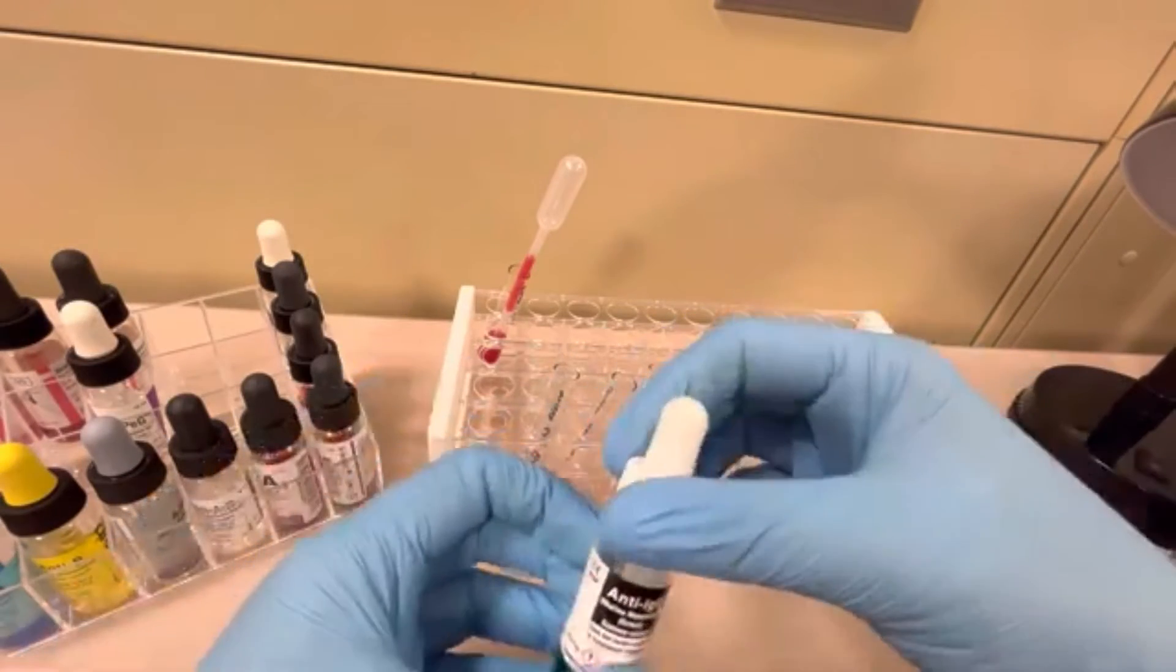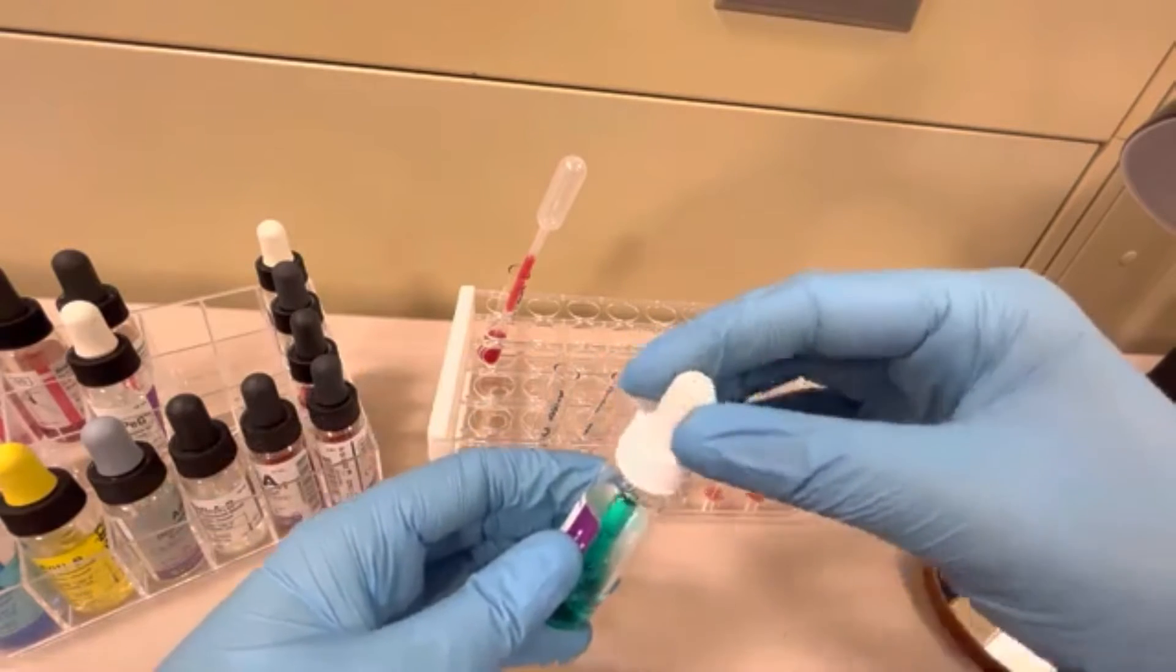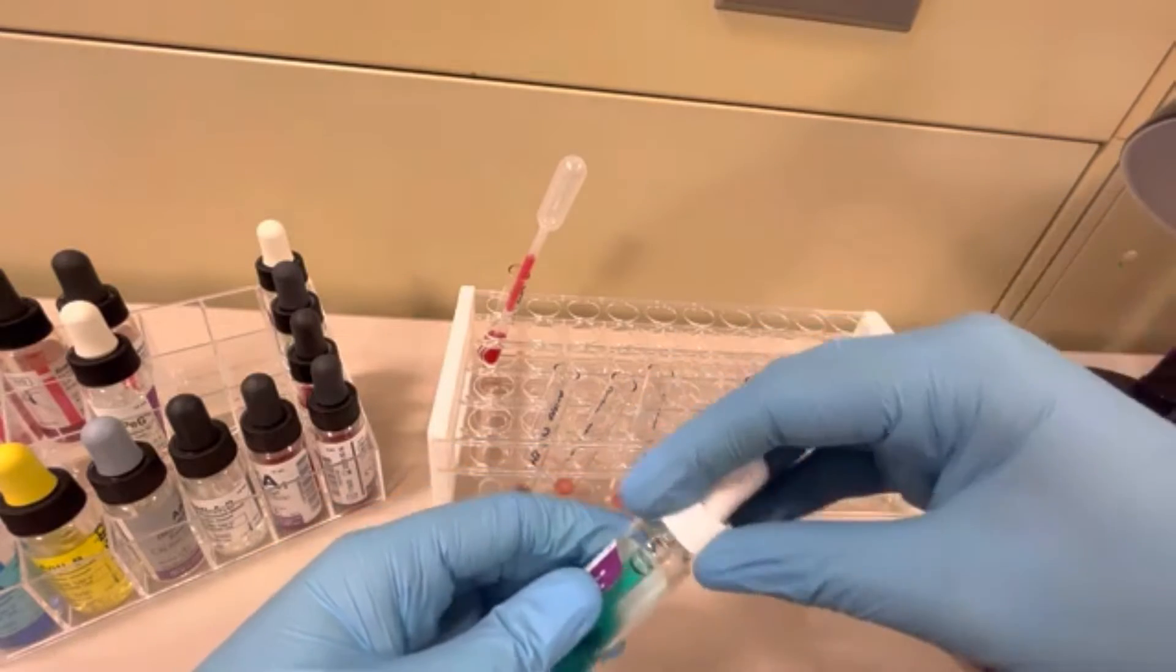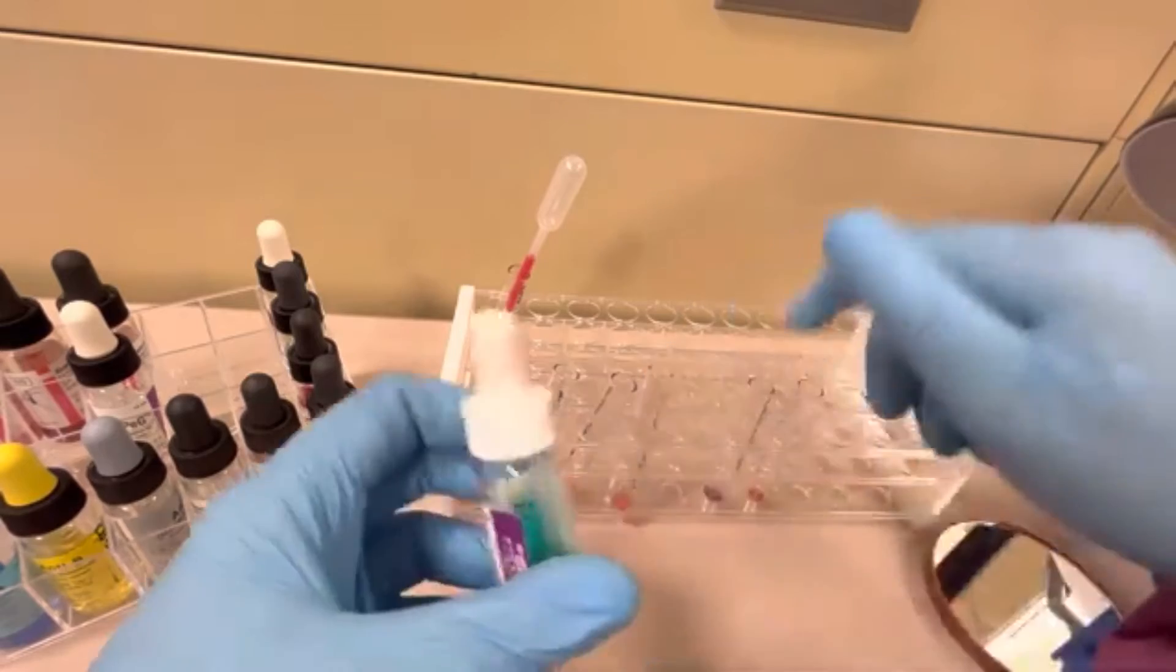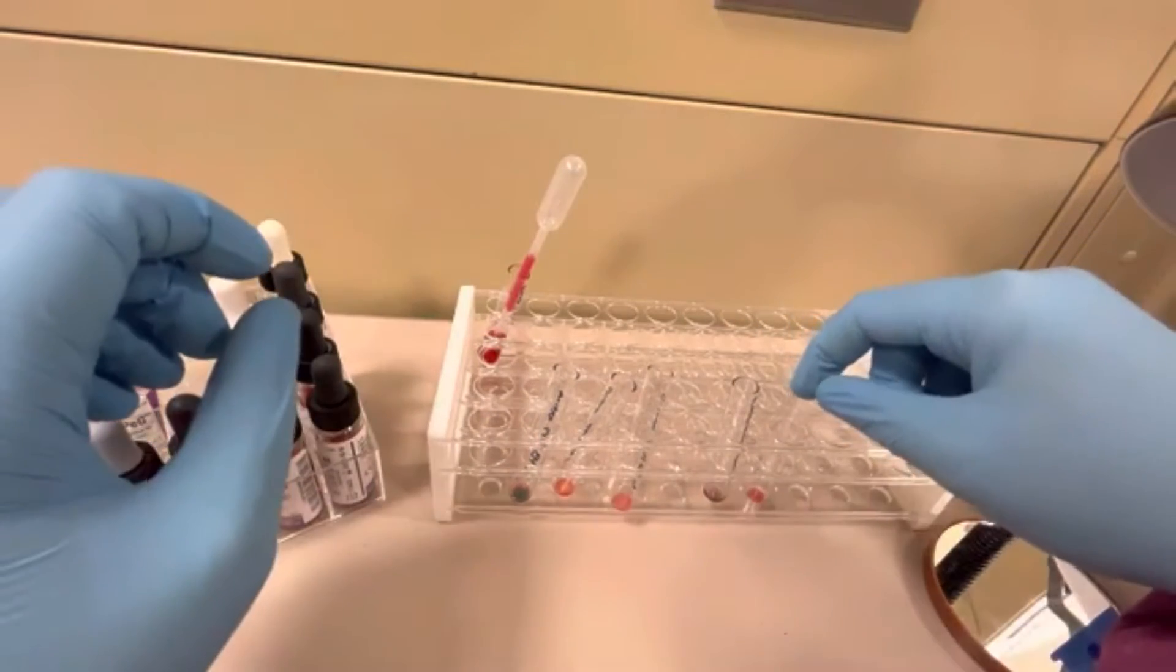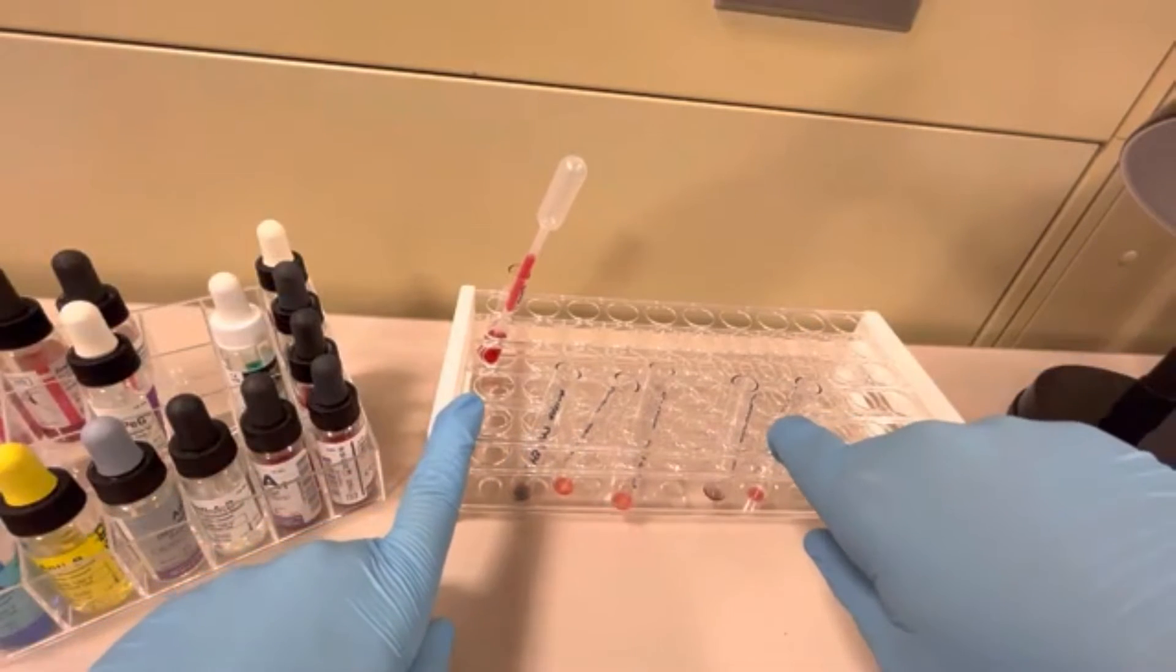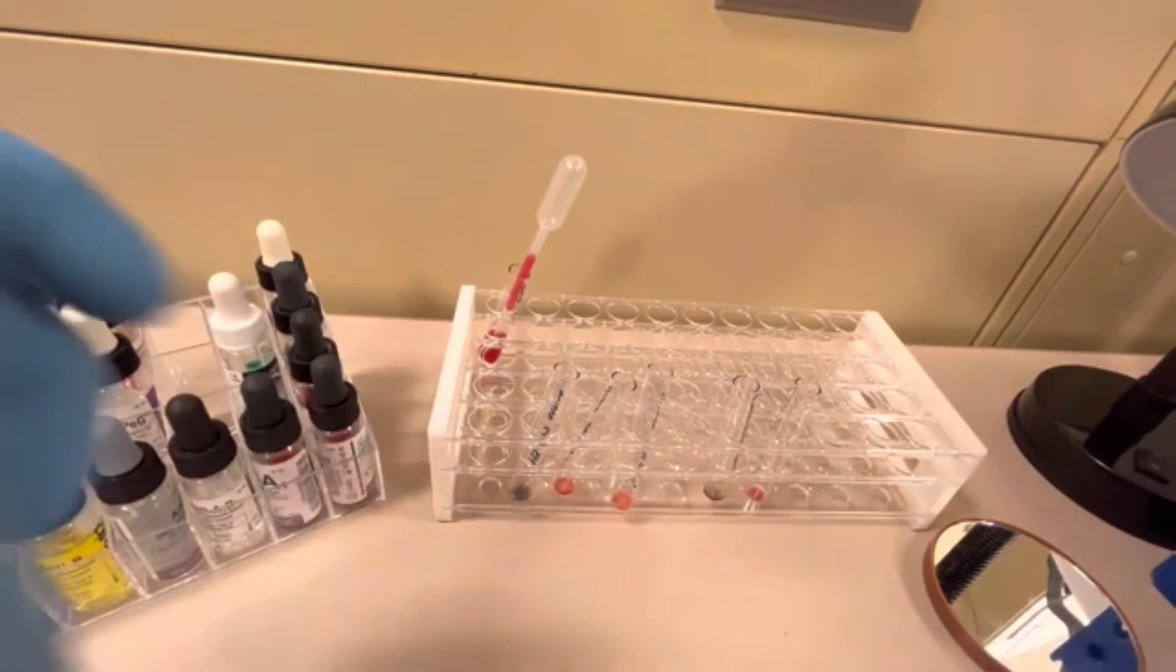And then the next tube is my DAT tube. I'm going to get a monoclonal anti-IgG, an AHG which is anti-human globulin, and I'm going to put two drops in there. I'm not going to put anything in here. It's just saline and a little bit of saline that's left over from the wash and then the red cells. And then what I'm going to do is spin all these for 15 seconds. I'm going to get my result sheet here and we'll be back in just a moment.